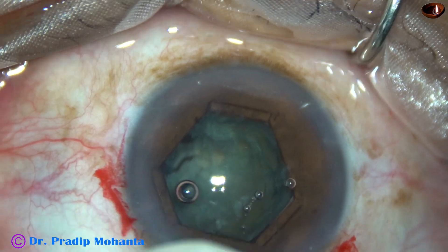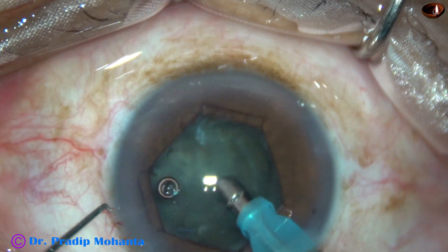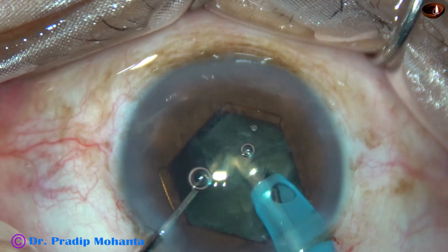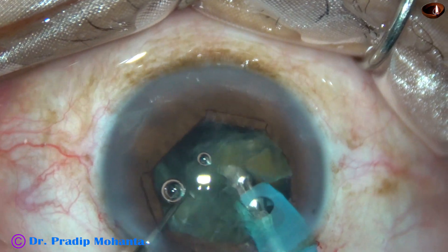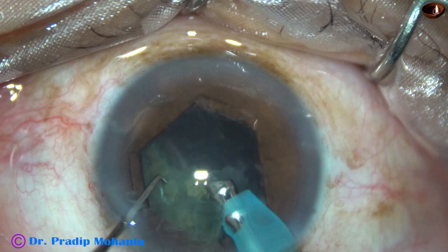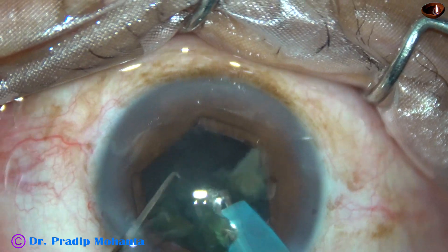Visibility is much more now. You can take all safety precautions. I am going to chop this nucleus into smaller fragments and emulsify those fragments. The phaco parameters: vacuum is 450, flow rate is 45 ml per minute, and ultrasonic energy used is 60%.